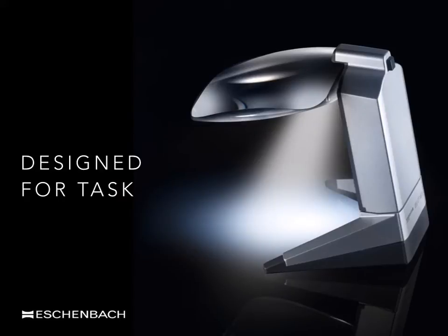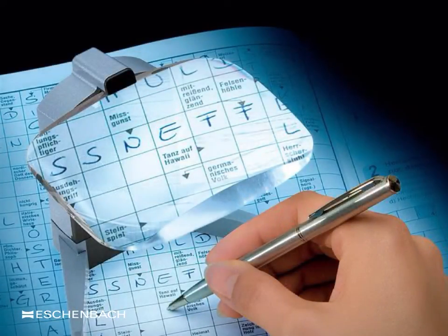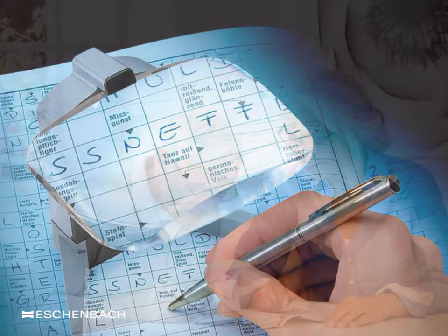Stand magnifiers are not just used for reading. A regular request is to be able to write underneath the magnifier. The Scribolux has been designed for this purpose and is being used here for a puzzle. The Scribolux has one of the largest lenses available, which has been mounted on a stand at a distance which will allow a pen to be used. It may also be used to sign checks or even write a letter.